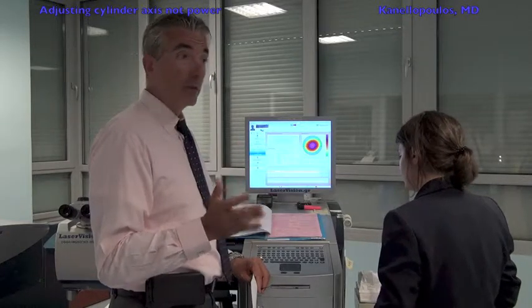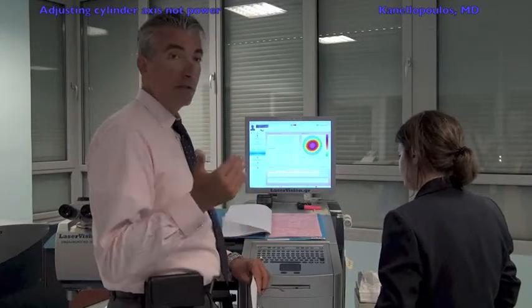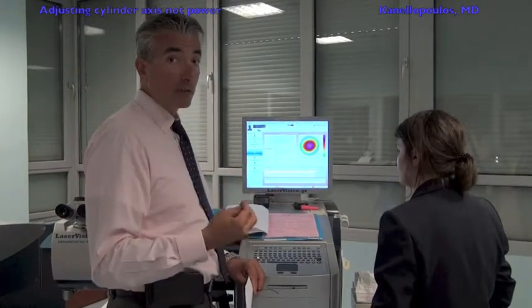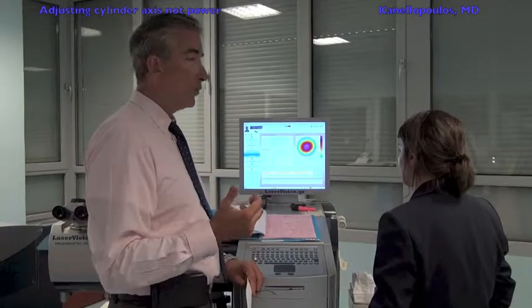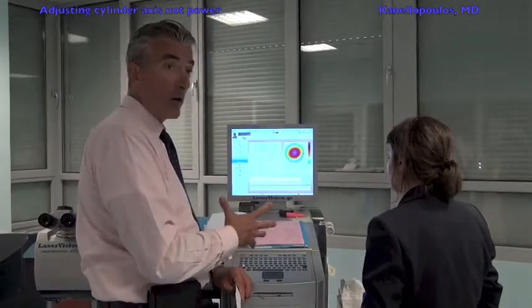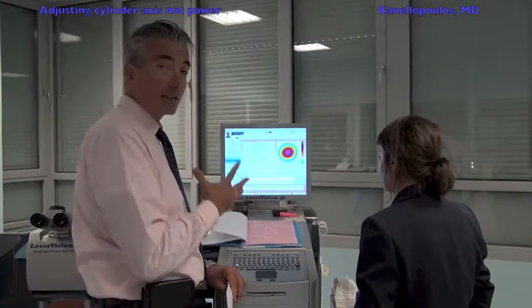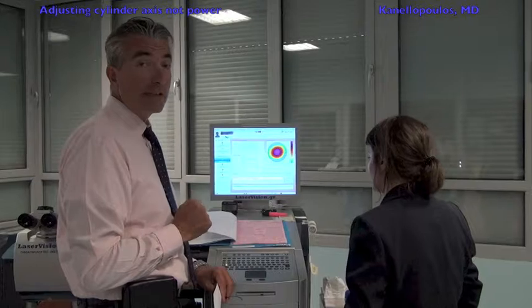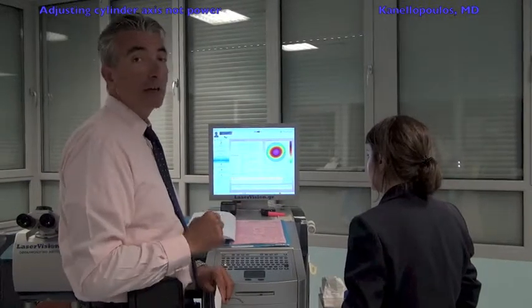that the patient is using, but the topography is the most reliable predictor of what is the actual astigmatism of that patient. And we'll talk a little bit about why the refractive cylinder and the placido-derived topography data may not be similar in all patients.